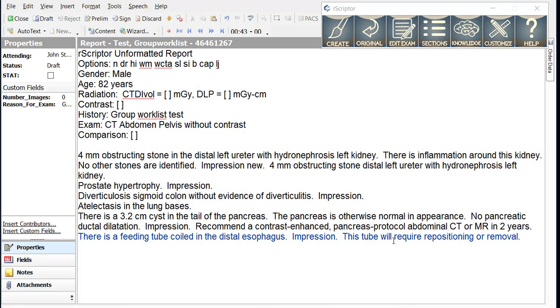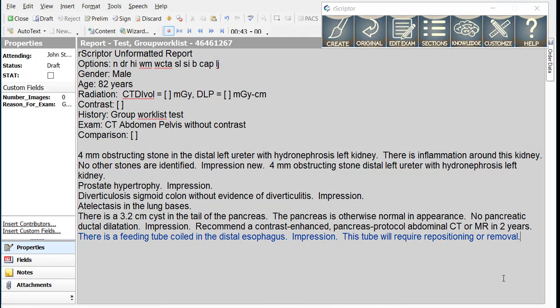Here I will introduce one of two commonly used modifiers. The first is critical period. This modifier tells R-Scripter that you recognize that this finding is a critical finding that must be called to the referring physician. If you do not include the critical modifier somewhere on this line of text, you will receive a warning by R-Scripter asking you to call the referring physician. So let's add that modifier now. Critical period.